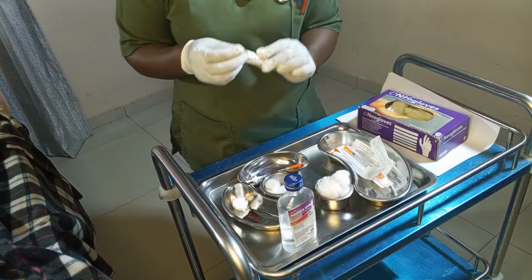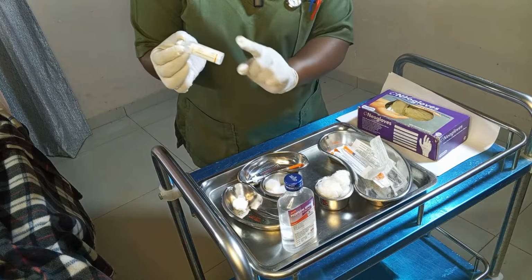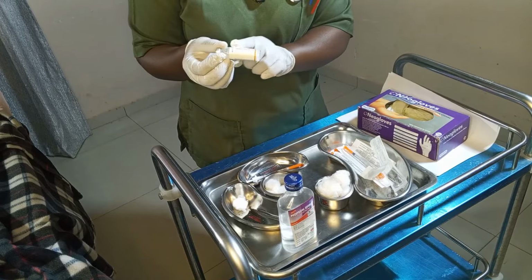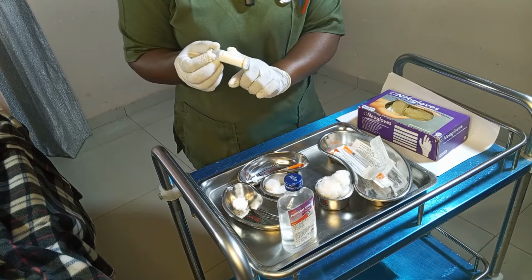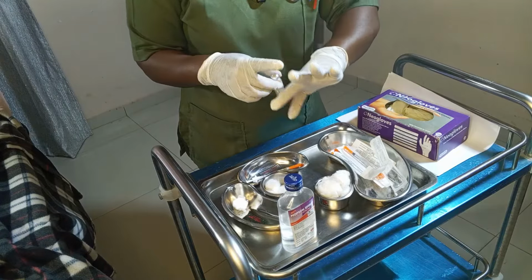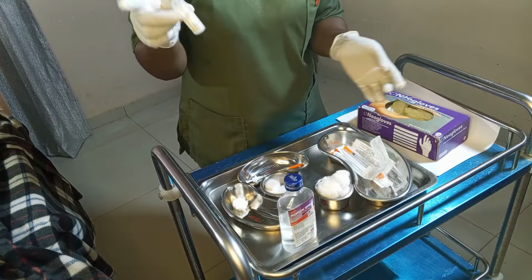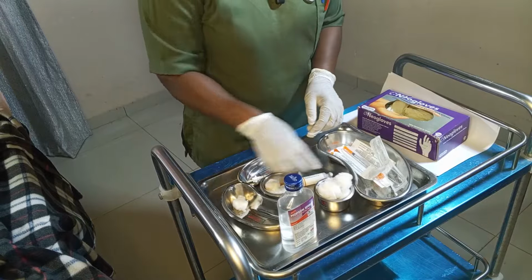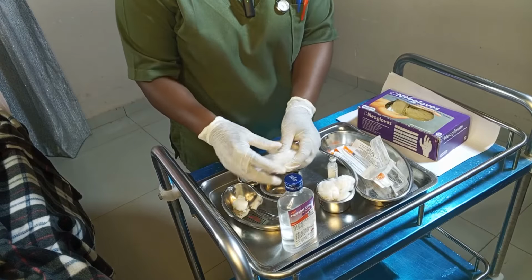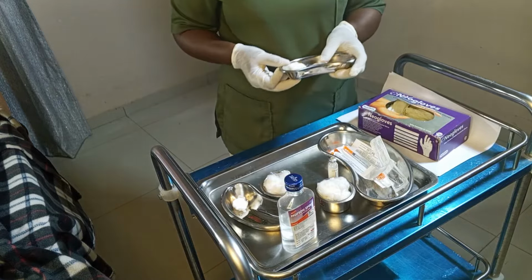Do not forget, whenever you're going to administer medication, make sure you check the color of the medication. Has the color changed? For this one, the color is still intact, and for the expiration date, the drug did not expire. So you have to observe the 5 rights, right? The right patient, right time, right medication, right route, and right dose, right? So I have checked all my 5 rights and I've prepared my medication, and then I'm going to place my spirit swab inside this receiver and my dry swab also inside the receiver and take it to the patient's bedside.